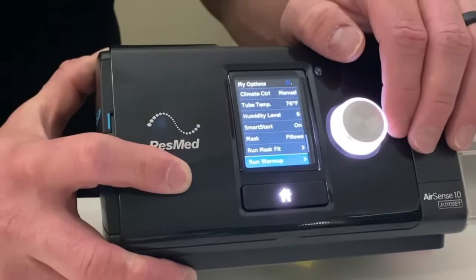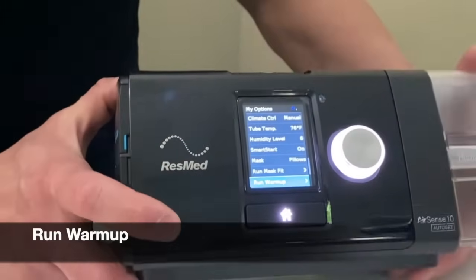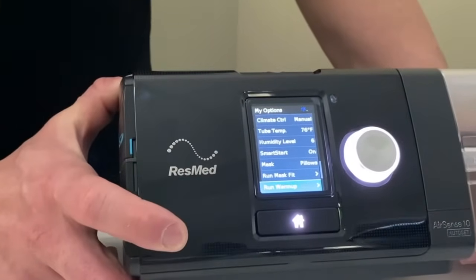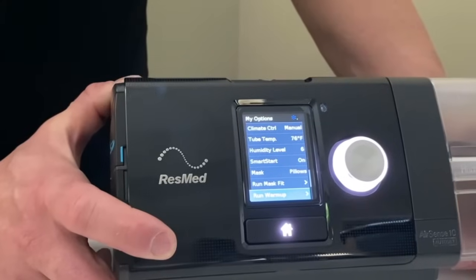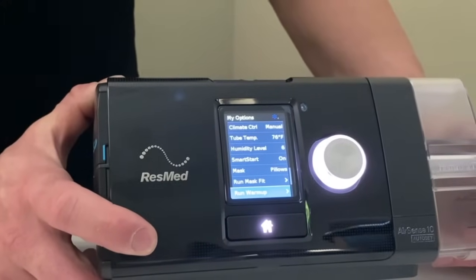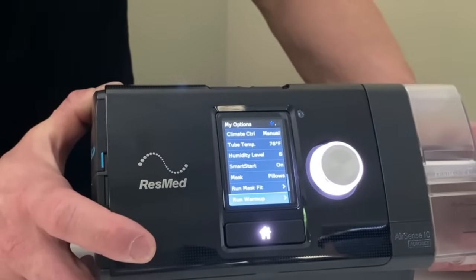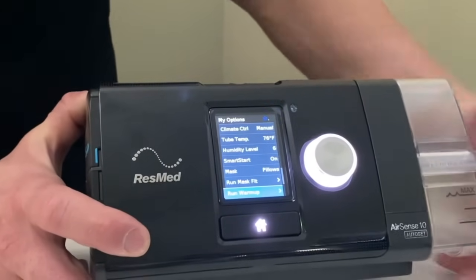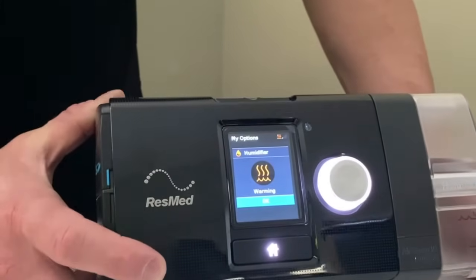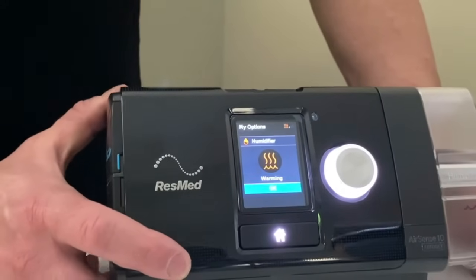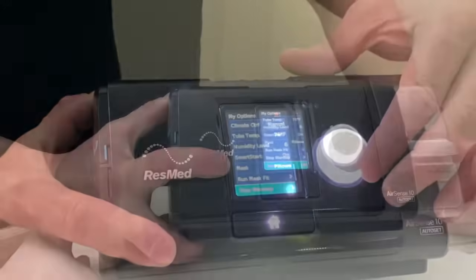Mask warm-up is something you can use but don't have to. What it does is start warming the humidifier before you turn your pressure on, so the first bit of therapy you get is more humidified. You don't have to use this because anytime your machine is running, your humidifier is also warming. But I do use this function when dealing with sinus issues or allergies — it helps clear those up.